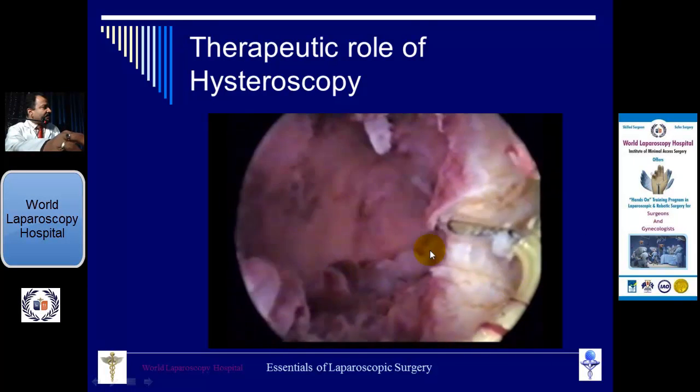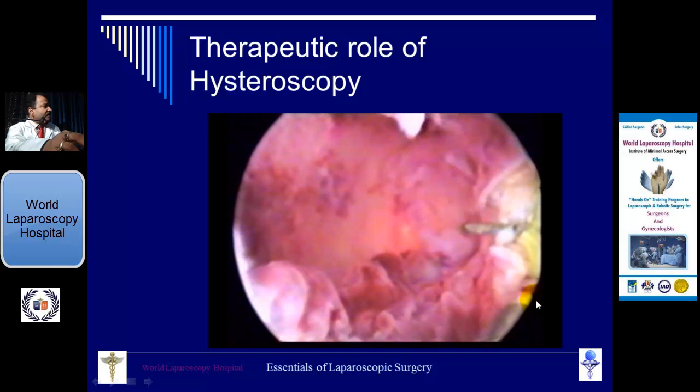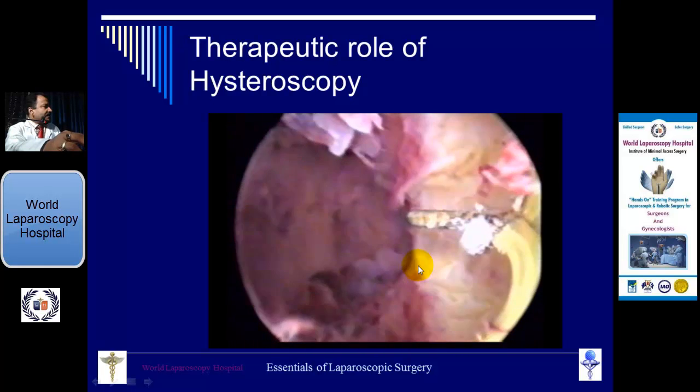Now see, the brightness of both is almost equal, and then it is the point where you have to stop. Here this is the point to stop.